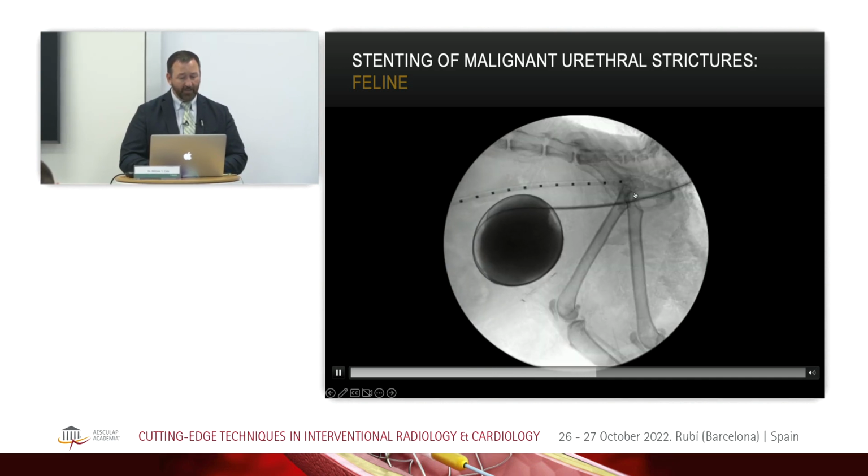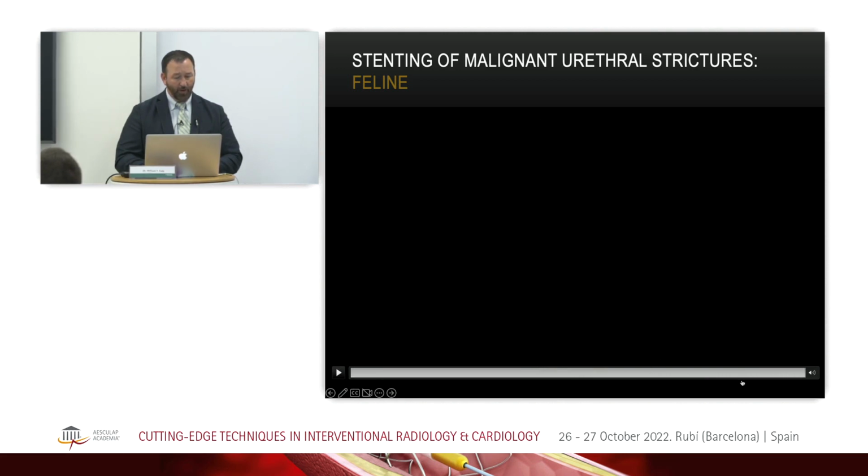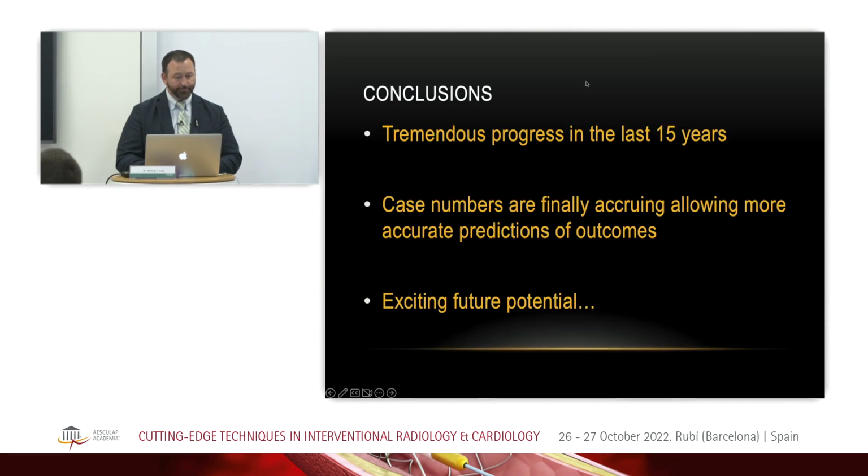And so the stent is coming in over the wire. It's a little bit harder to see this stent because it's a little dark in the bladder. But we're going to pull back the stent. The opening is going to be right about here. Starting to open the stent, you can see it engaging the tumor and then coming back with a nice opening right in this region here. And that's the region that's most affected.